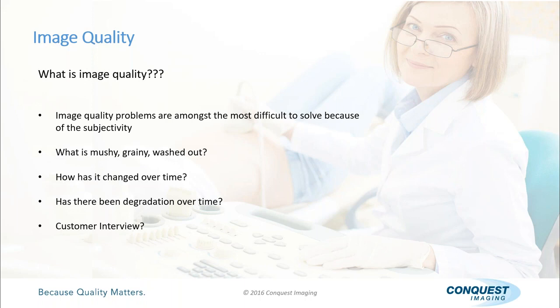Right. Because a lot of times they'll say, oh, it's not working. Yeah, it's broke. Well, what's that mean? No, they'll just write it broke. I'm like, so what's new? So usually I just find the text and I said, tell me what it's not doing. It did yesterday and it's not doing today. You know, a lot of times you'd be surprised. Yeah. They know. I mean, they wouldn't be complaining about nothing, or generally they're not, right? But trying to get that information from them sometimes is difficult.